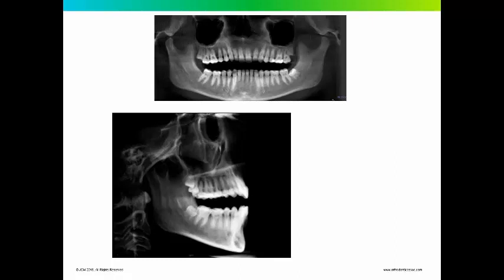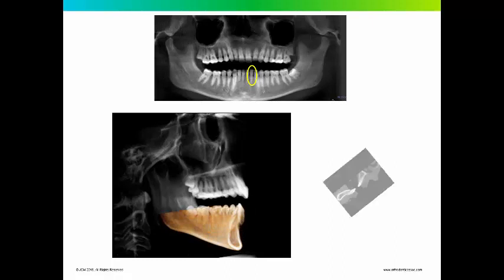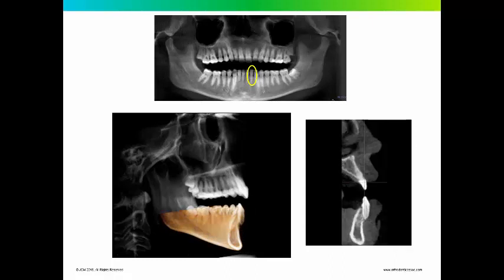If you take a look at the lower left lateral incisor from both the pan and the ceph, it looks completely normal. However, when you start looking at that from a cone beam or a 3D perspective, you get a different picture. You see how the tooth is pushed outside of the alveolar housing. And when I say that with class 2 correctors, if you're using a cephalometric x-ray to evaluate your results, the same thing happens. You really get a kind of false sense of security that those lower incisor roots are still within the alveolar housing.